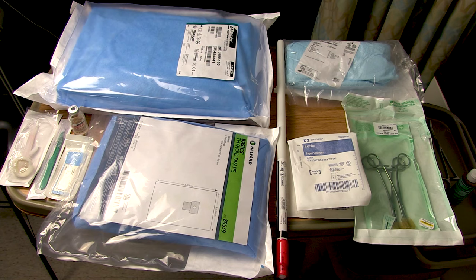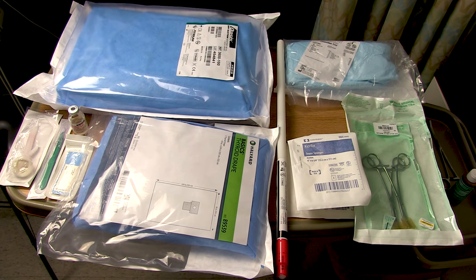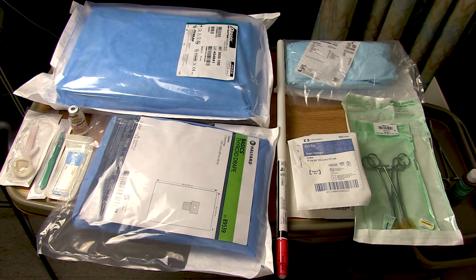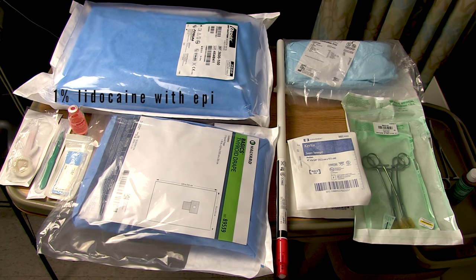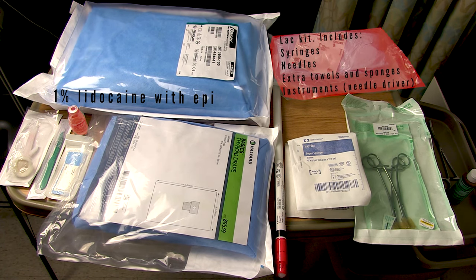But if you have the time, you should get some more things, including a water seal suction chamber like this Atrium device. You want two pairs of long skinny curved clamps — classically these would be Kellys. For any procedure I always recommend a generous pack of gauze. Unless you're in a trauma or crash situation, you should have something to prep and drape with — I've got a stick of chlorhexidine and a thyroid drape. Unless the patient's already anesthetized, bring some local, as well as a syringe and needles. I like using the emergency room laceration tray from my hospital's ED because it includes the syringe and needles I need and also has some extra towels and sponges.